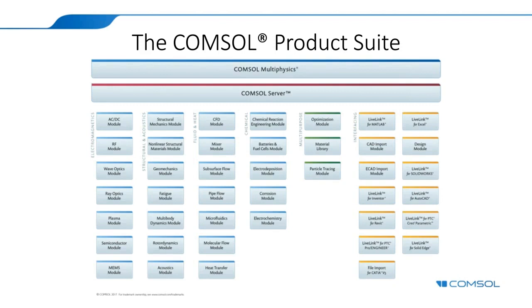All right. I might have covered that the last time through, but let's look at it again. The equation itself is actually very straightforward. I have to create an equation whose expected value is 0. So I want to give it two components across a minus sign, and I want those components to be equal. The first component I gave it was the average temperature on my thermocouple, which I created using that component coupling.